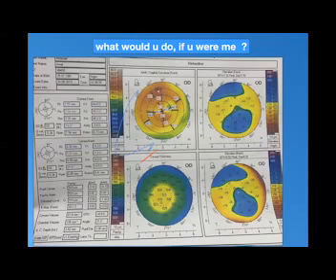The y coordinate is minus 1.2, right? The elevation within the accepted range. Anterior elevation in the superior. This is the OD, the right eye. So the nasal part is with high anterior elevation, but the back elevation is good.